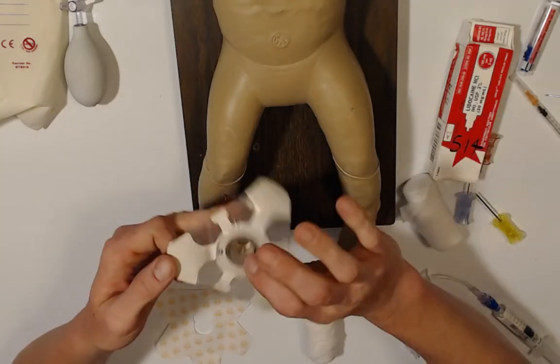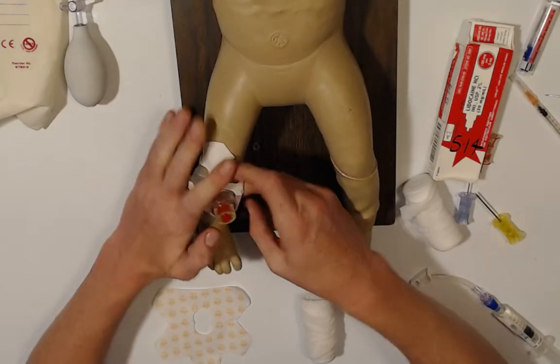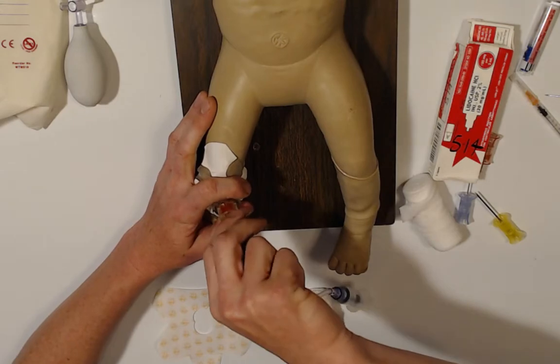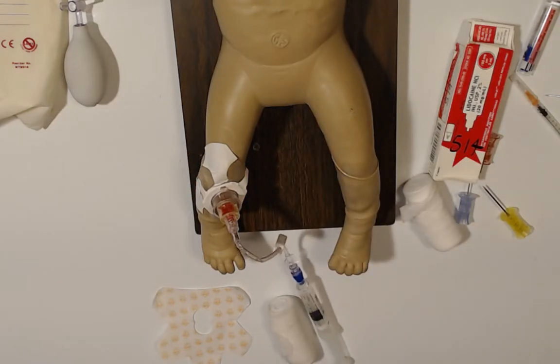This one only has 1. So this goes right over the top. Okay, this would stick to the leg, and then my tubing comes on top, screws snug, and that would hold everything in place. Okay. With that being said, that's about it.